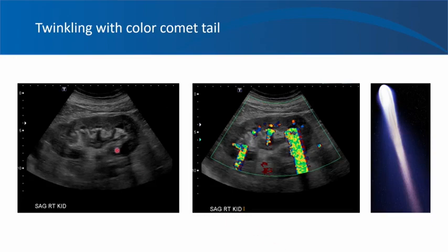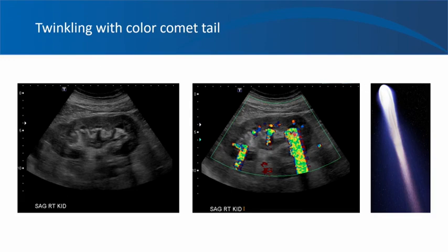In this kidney ultrasound, you are seeing some stones with some acoustic shadowing. On the corresponding color Doppler image, you can nicely see different foci of alternating colors — the twinkling artifact — with one stone here, one here, one here, and another one here. If you notice the difference from the previous example, these twinkles have long tails along with them, sometimes called color comet tail artifacts. The presence of these tails depends on the machine you are using and the Doppler mode settings.